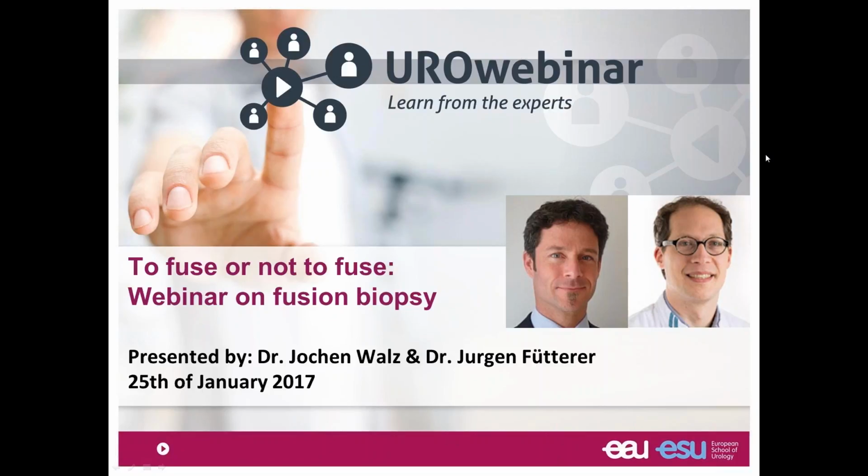And I'm still a little bit not sure whether doing MR in all patients before the first biopsy, before any biopsy, is cost effective or affordable. And of course, we have some cost effectiveness studies coming from Nijmegen that show that it is cost effective.